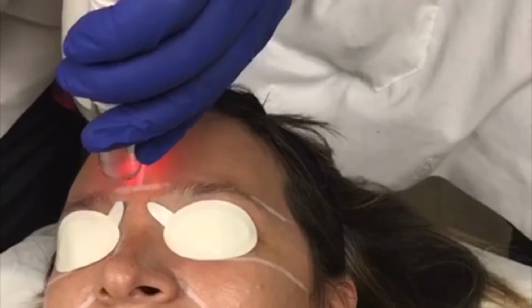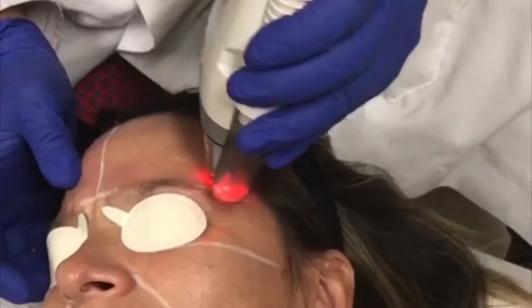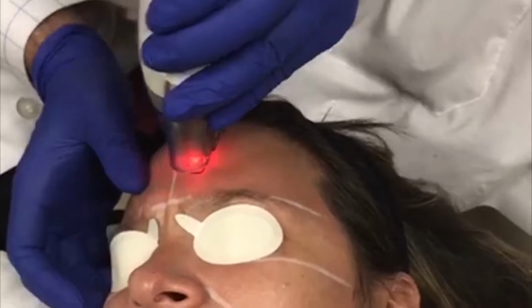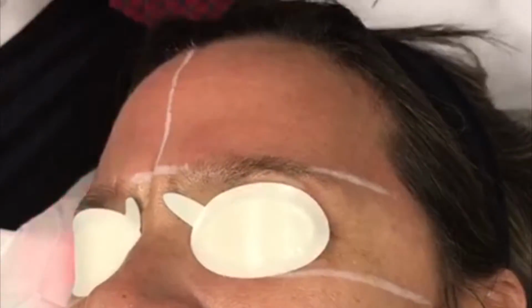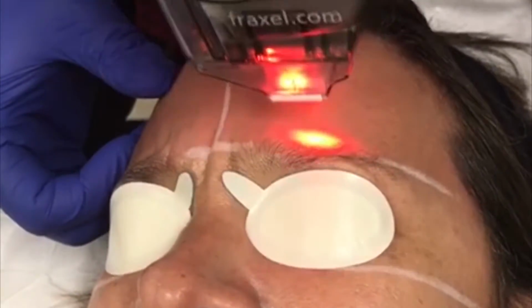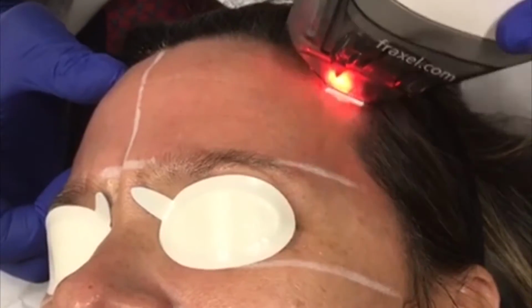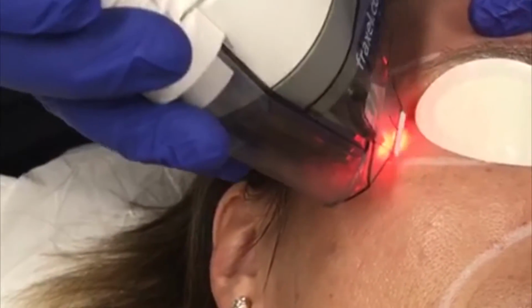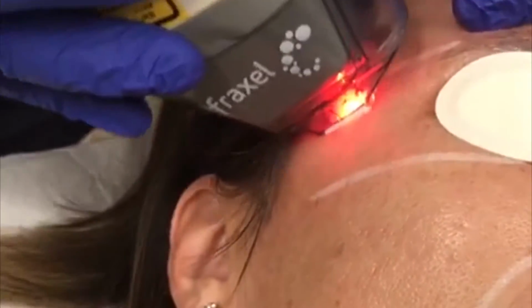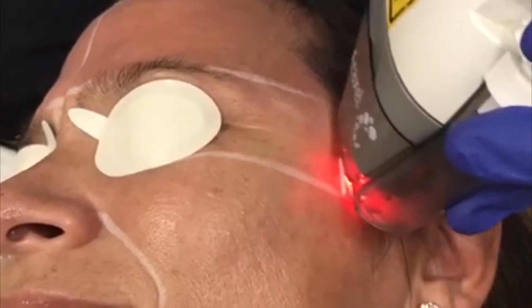For patients who are getting a full facial and neck fractional resurfacing, I usually advise them to make sure they're using sunscreen on a regular basis prior to the treatment, and also we stop treatment with any retinoid products that they may be using, whether that's prescription retinoids or retinol that's over the counter. For patients with darker skin color, I sometimes pretreat with hydroquinone for a month once daily to decrease any pigmentation that may be a problem post-laser. Patients with dark skin, I also prescribe hydroquinone after the treatment for a month once daily to decrease any post-inflammatory hyperpigmentation.